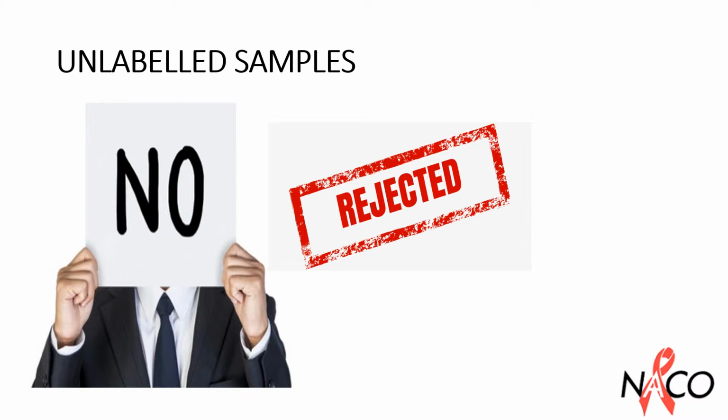Common specimen types like urine, stool, swabs, sputum, and blood, which can be easily recollected and cannot be identified with certainty, should require recollection and can be rejected.